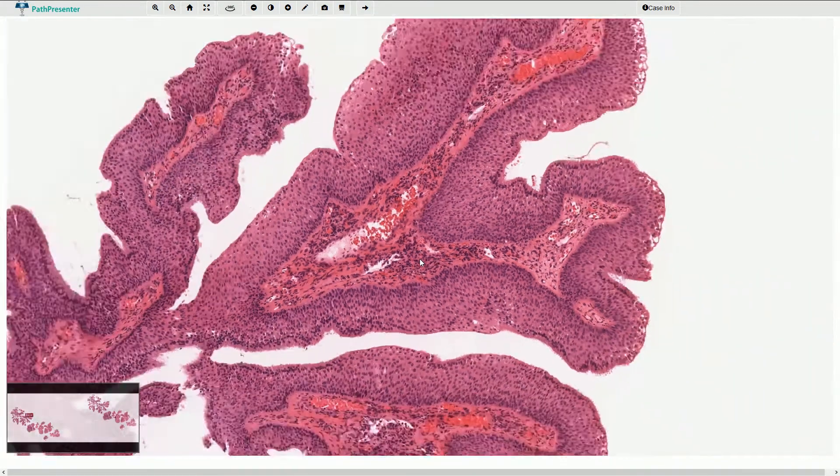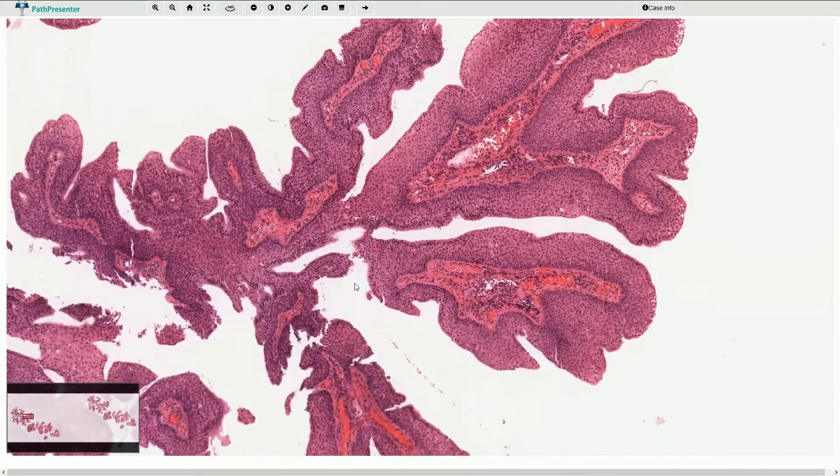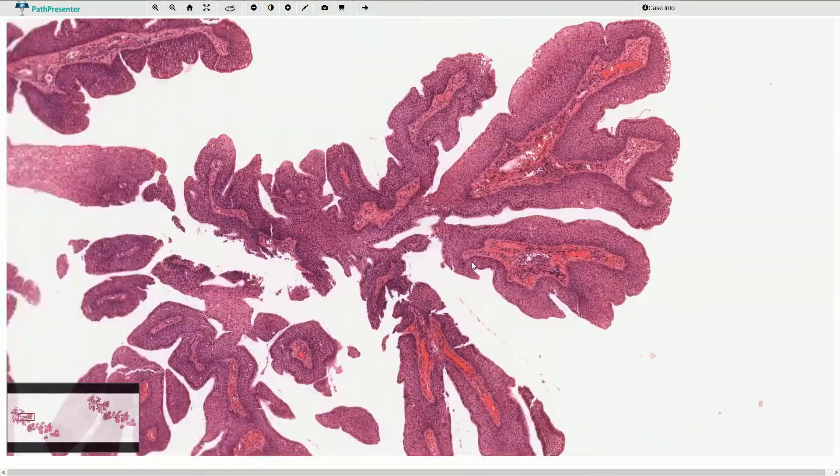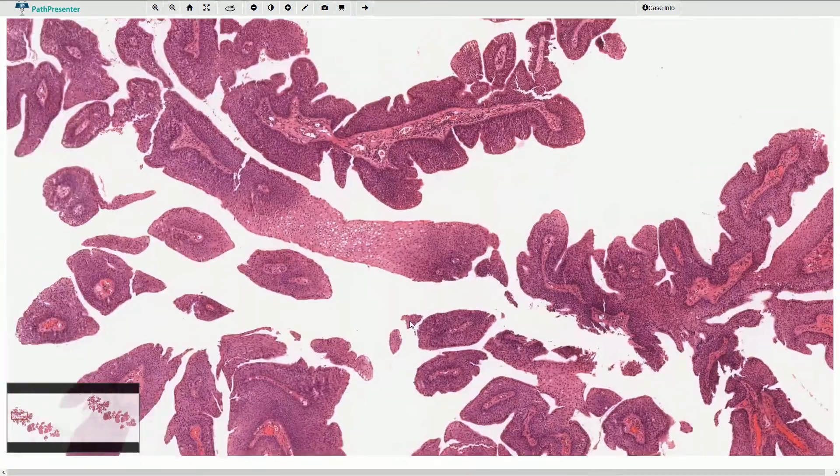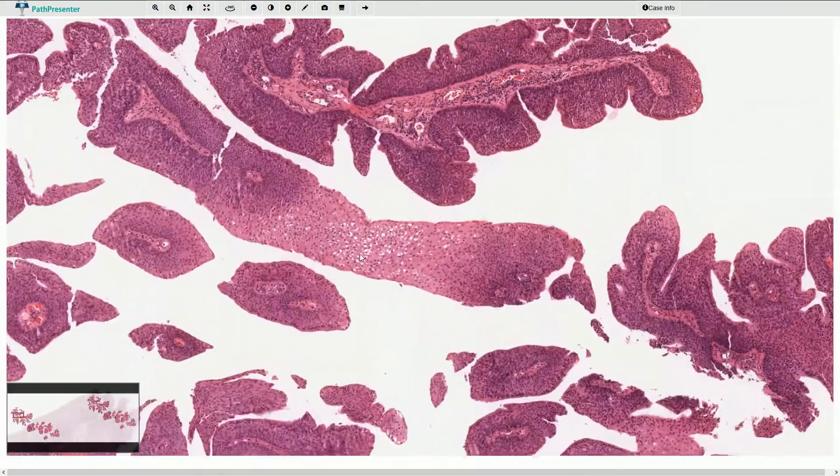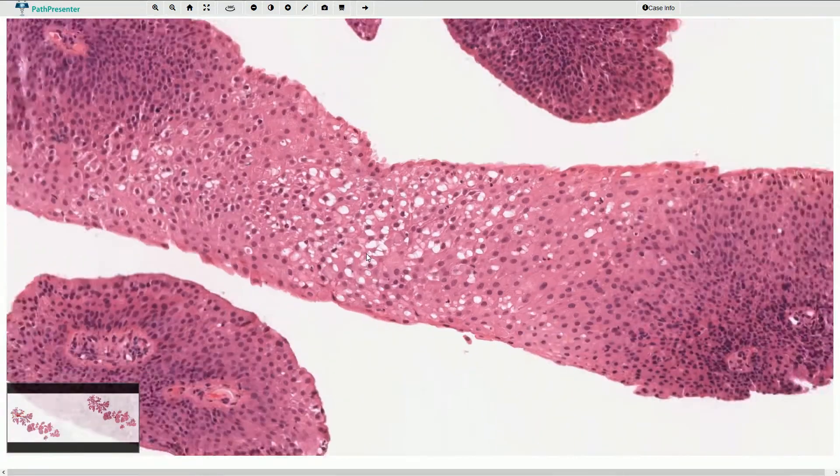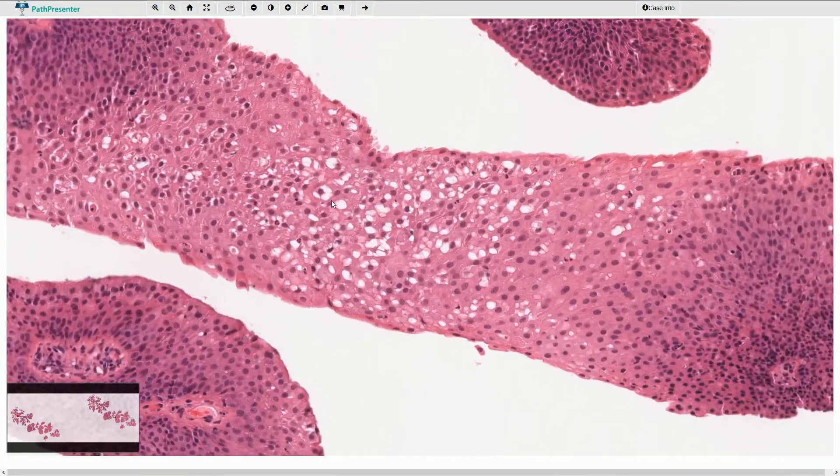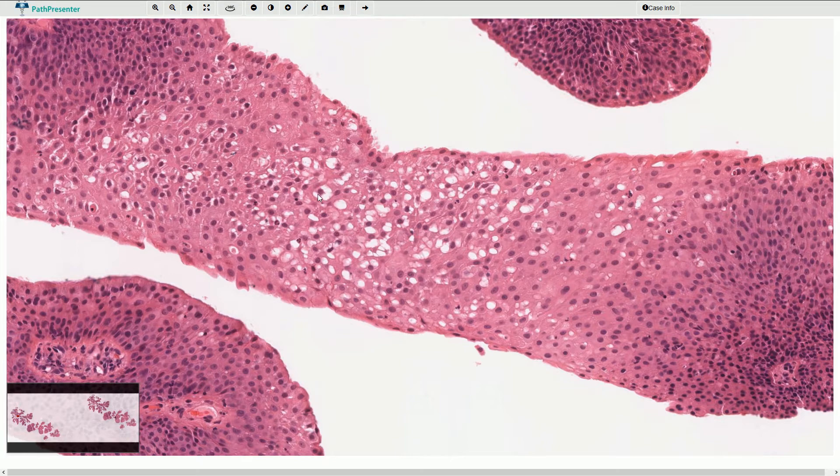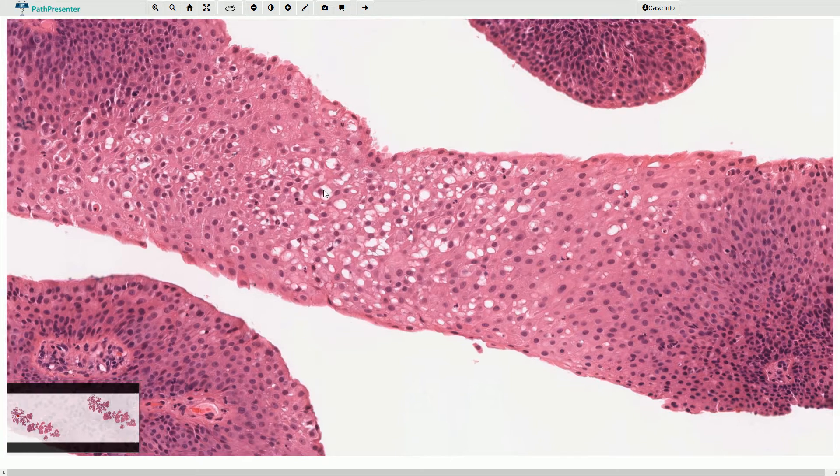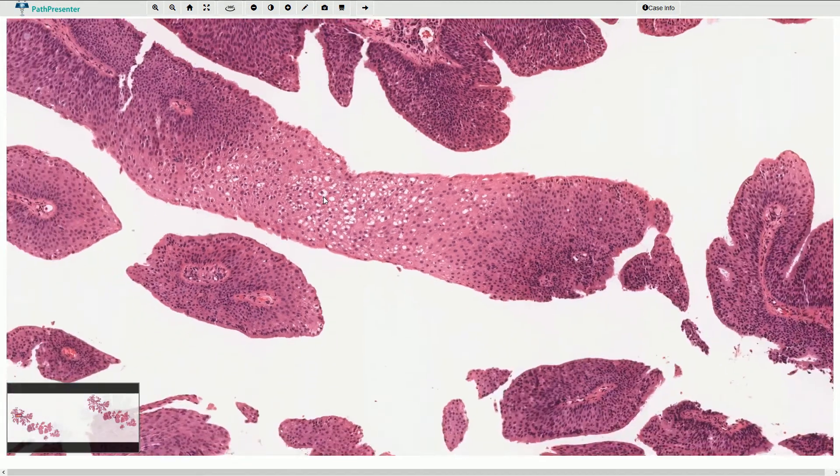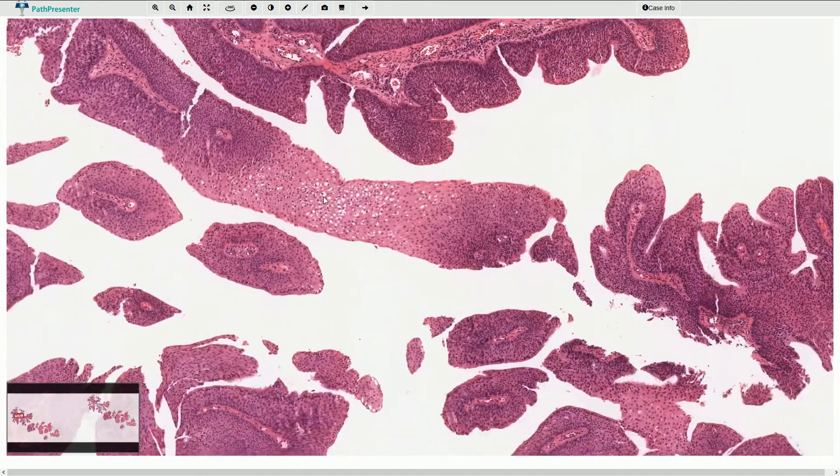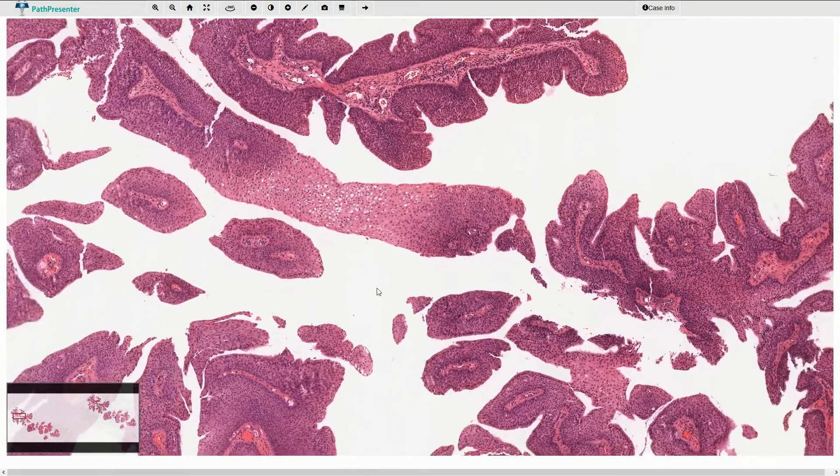In some parts, usually superficial, we can find koilocytic changes, for example here. We have keratinocytes with slightly irregular nuclei and clear halos around the nuclei. These changes are commonly associated with HPV infection.